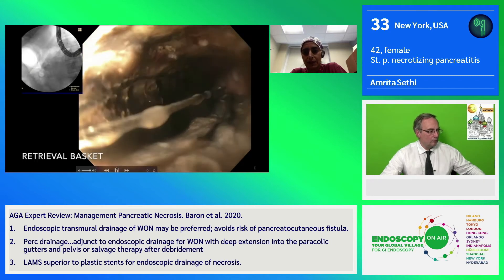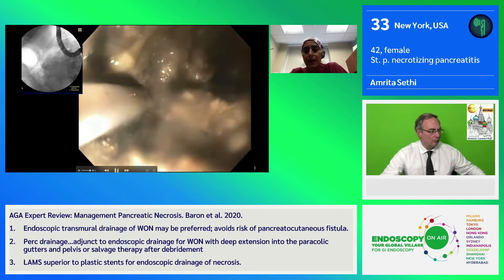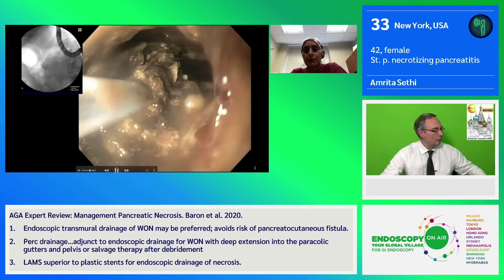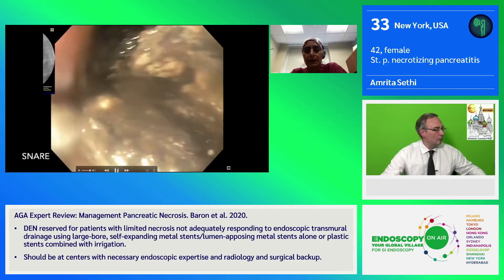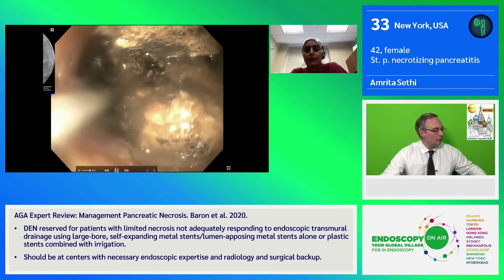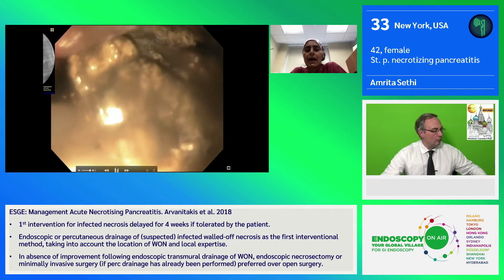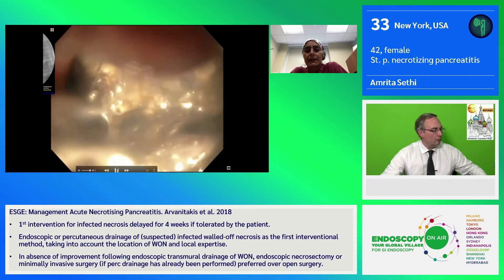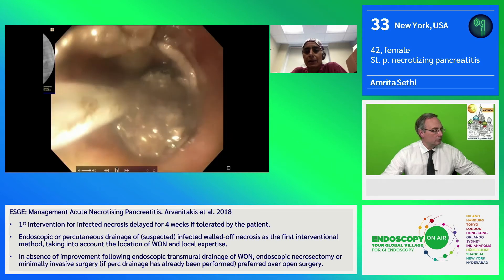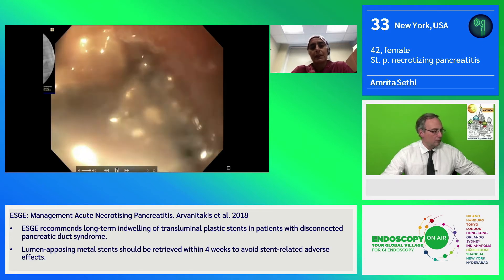A retrieval basket can also be used, but as you can see, given the consistency, it can be difficult to get tissue within the basket itself. You can see on the fluoro, the angulation of the scope sometimes can make these maneuvers difficult, as one has to come out of the cavity itself. We tried a snare as well. This can be used to advance over the tissue, but one of the problems is that even while it has a good grab on the tissue, the trailing amount of material is too large to come out of the fistula, and therefore the actual amount of removed tissue always does seem to be less than desirable.